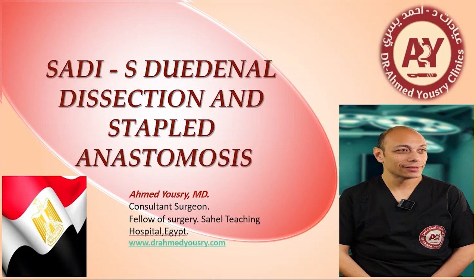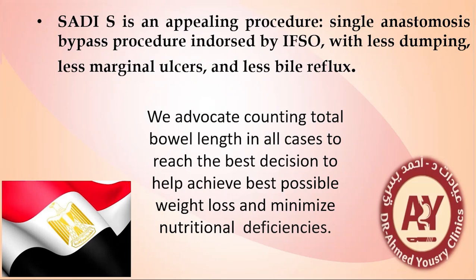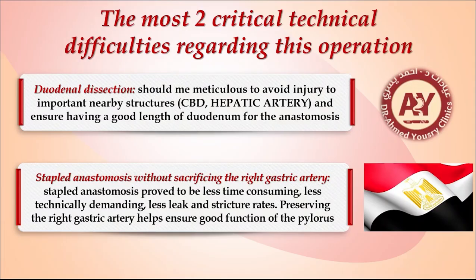SADI-S Duodenal Dissection and Stapled Anastomosis. SADI-S is an appealing single anastomosis bypass procedure endorsed by IFSO, with less dumping, less marginal ulcers, and less bile reflux. The duodenal dissection should be meticulous to avoid injury to important nearby structures, namely the common bile duct, common hepatic artery, and ensure having good length of the duodenum for the anastomosis.